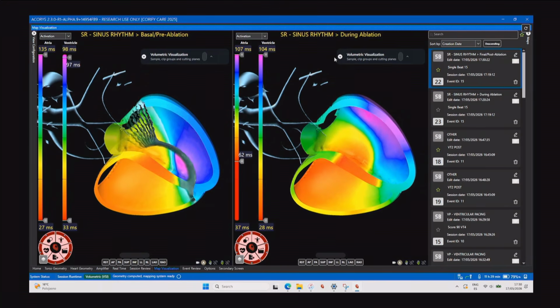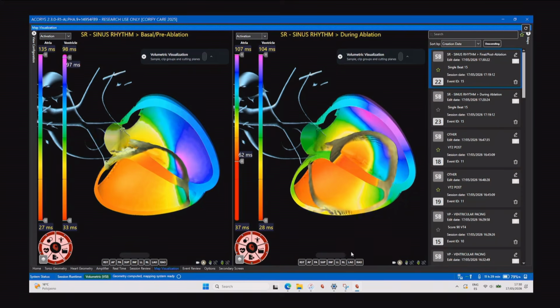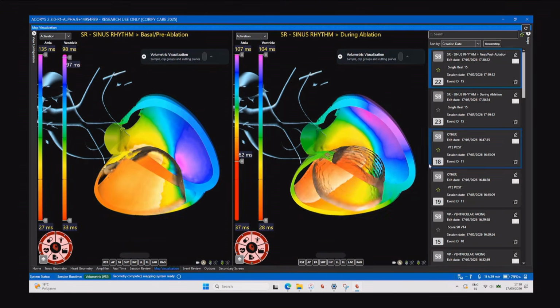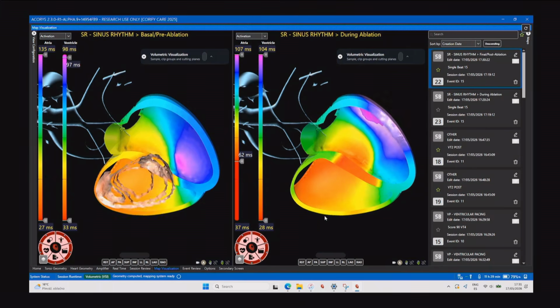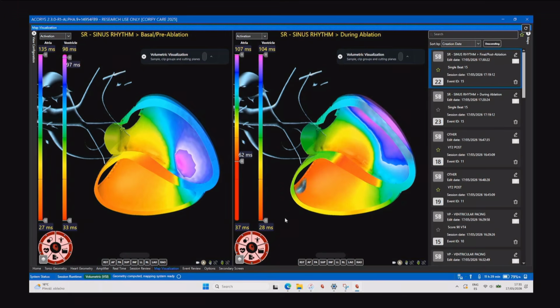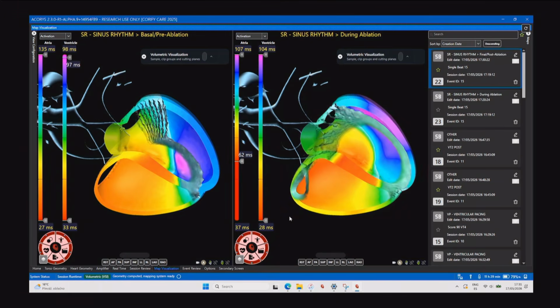Okay? You see clearly a slow conduction in this region. If you propagate the actual map, it's not perfect, but as you see, there is late activation, but I think there is much less slowing conduction. So I believe the late activation moved from the kind of late potentials which we saw, and we are trying to abolish more to a different region, and also it's a much larger area.